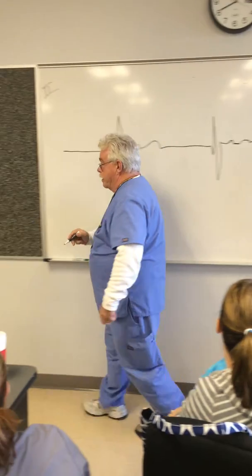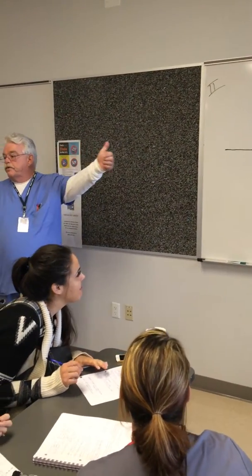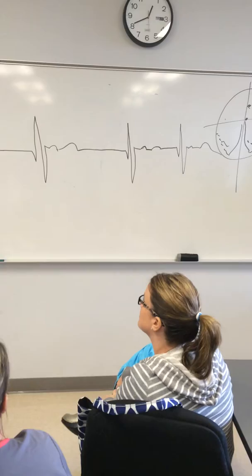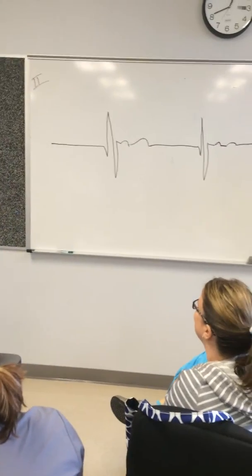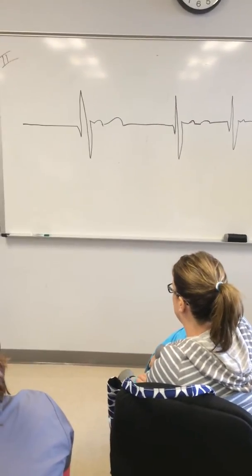Now look how pretty yours is. First question: what's the rate? Is this regular? Yes, it's regular. What's the second question? What's the rate? 55. Still junctional.